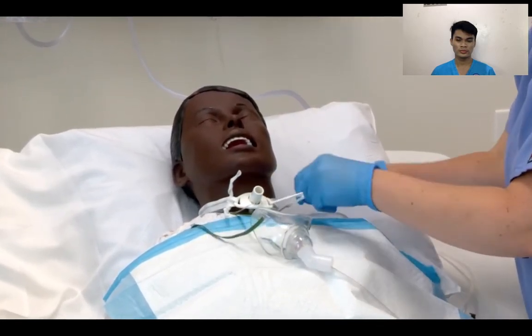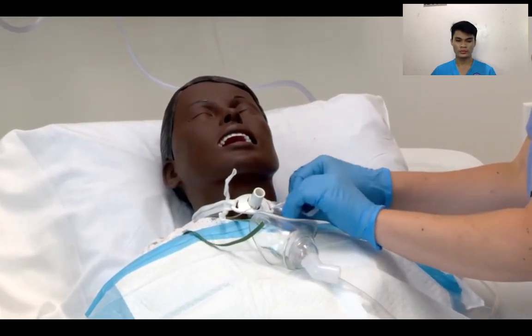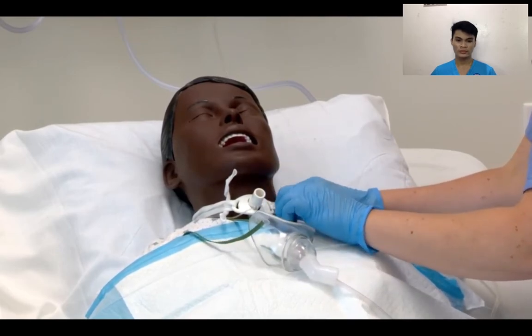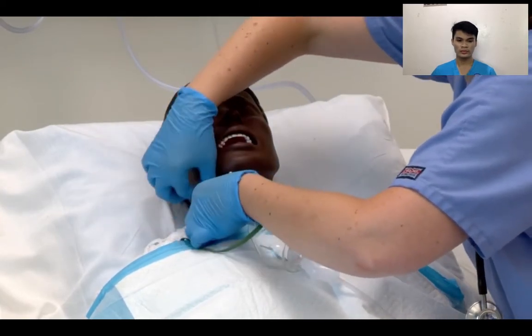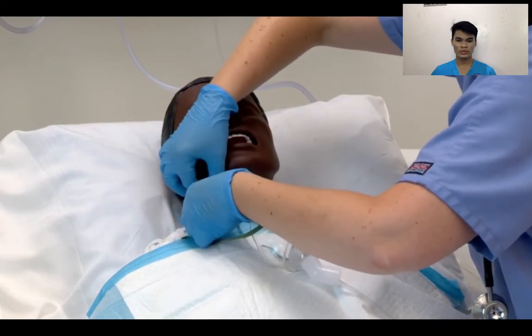You never want to loosen the trach ties before you have new ties in place unless you have another person here to hold it for you. You don't want this trach to become dislodged. Okay, now I'm going to untie this side and remove the old ties.